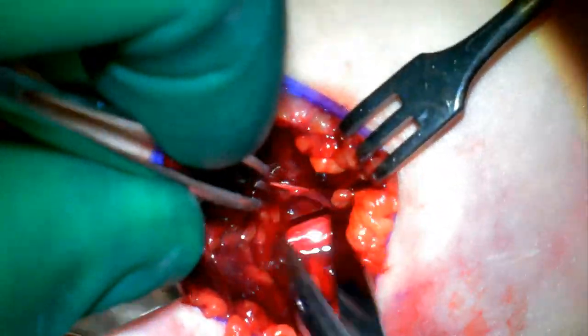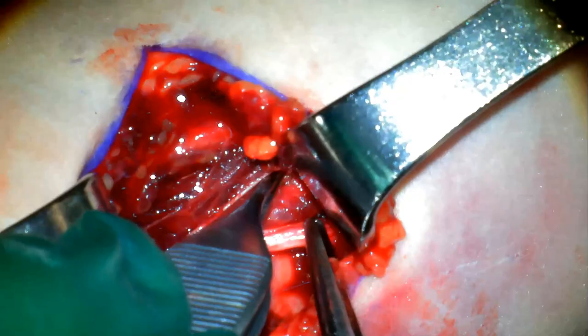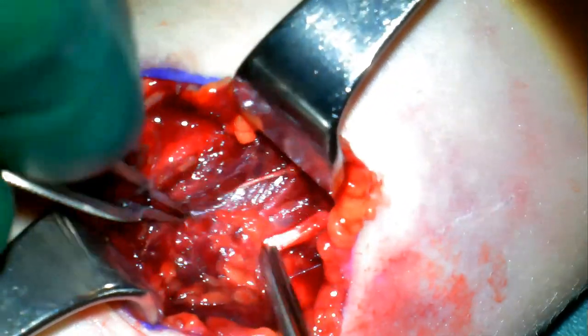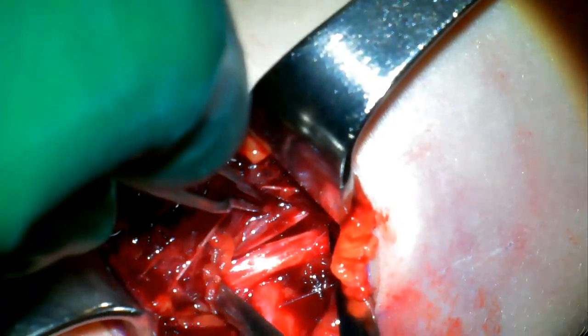Here I am looking for the nerve, and there it is. You can see it's covered in fracture hematoma, and there's the humerus behind it. So I'll use a blue vessel loop in order to tag that nerve. You can see immediately adjacent to the nerve is the brachial artery, and we'll tag that as well.